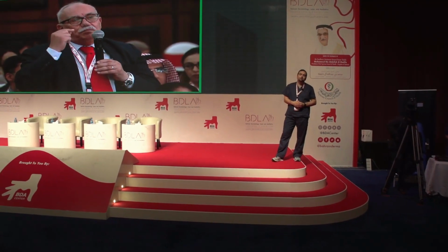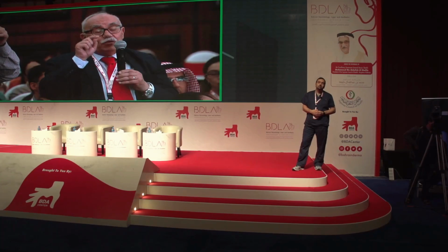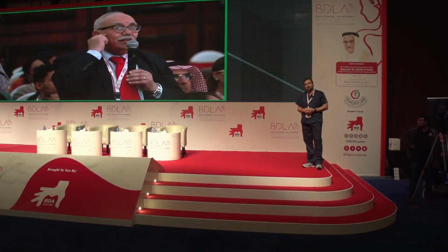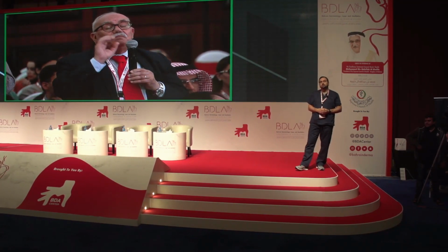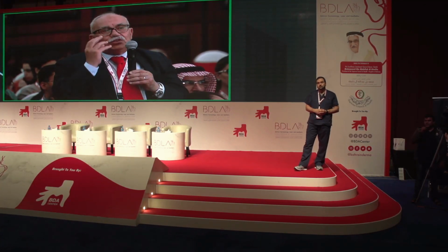So I prefer to go vertically on the zygomatic body, on the most tip of the zygomatic body, and have another puncture more lateral, on the lateral ramus of the zygomatic arch. This will become more natural, and the patient will not feel a localized cheek lump, swelling.